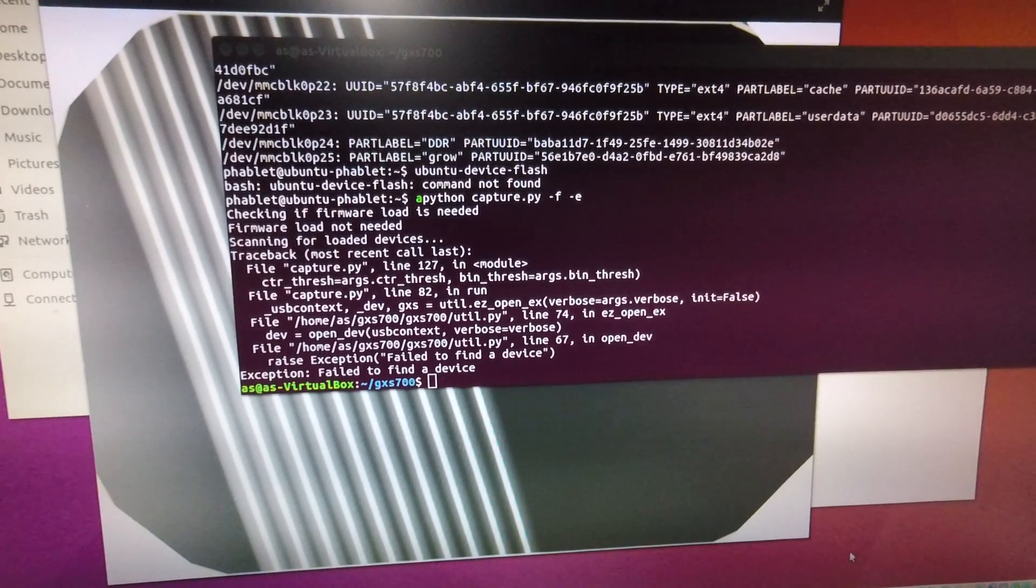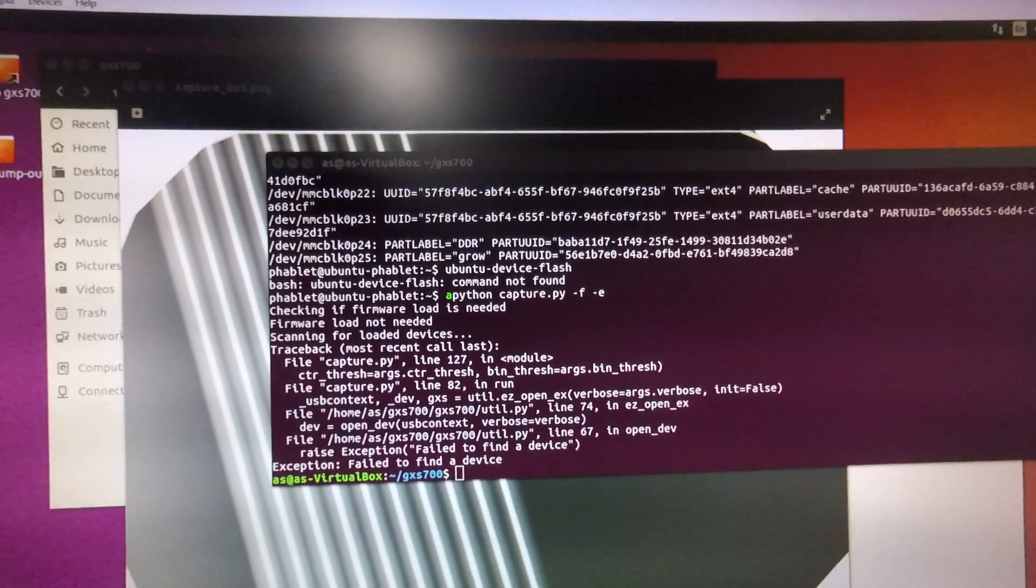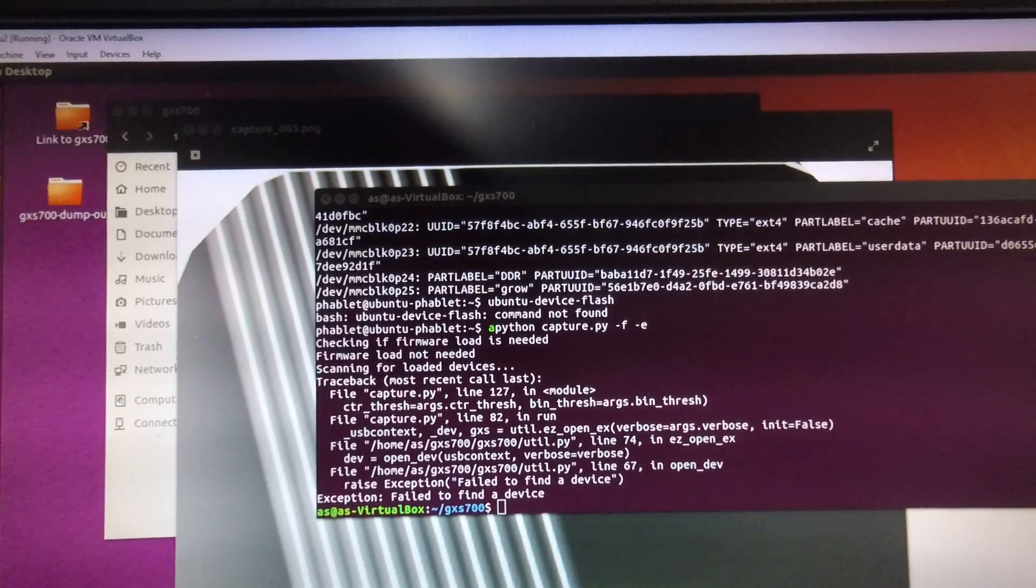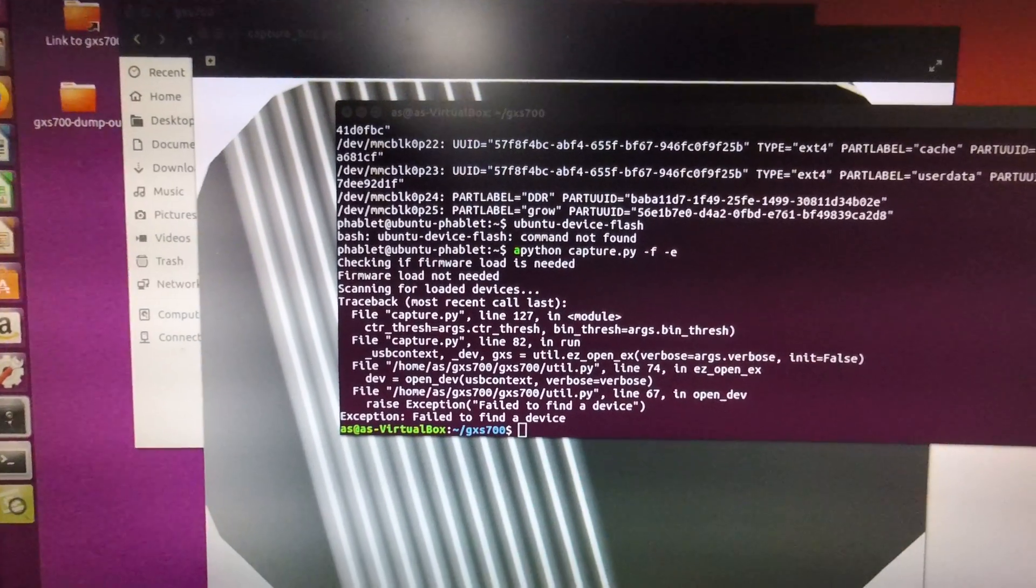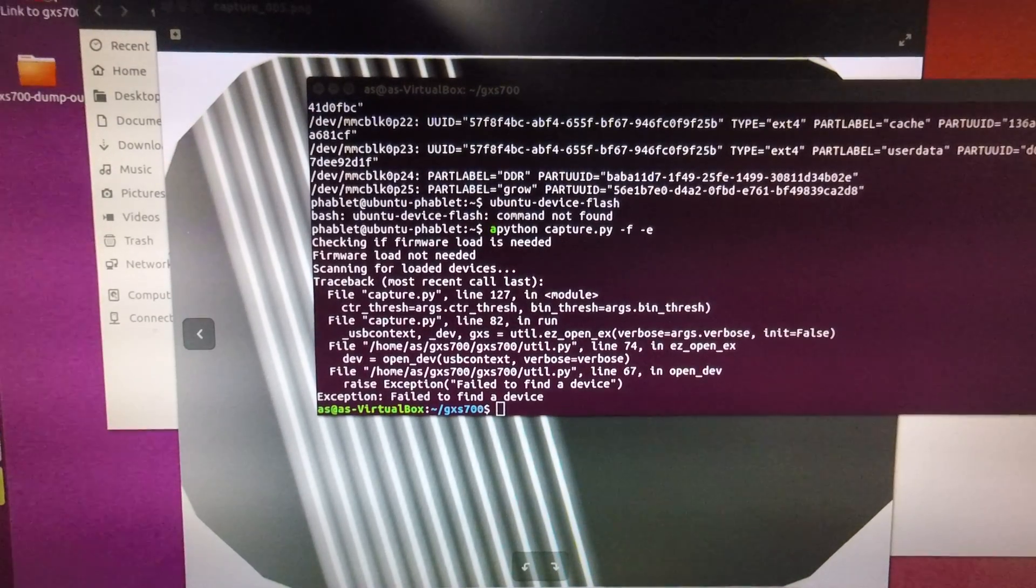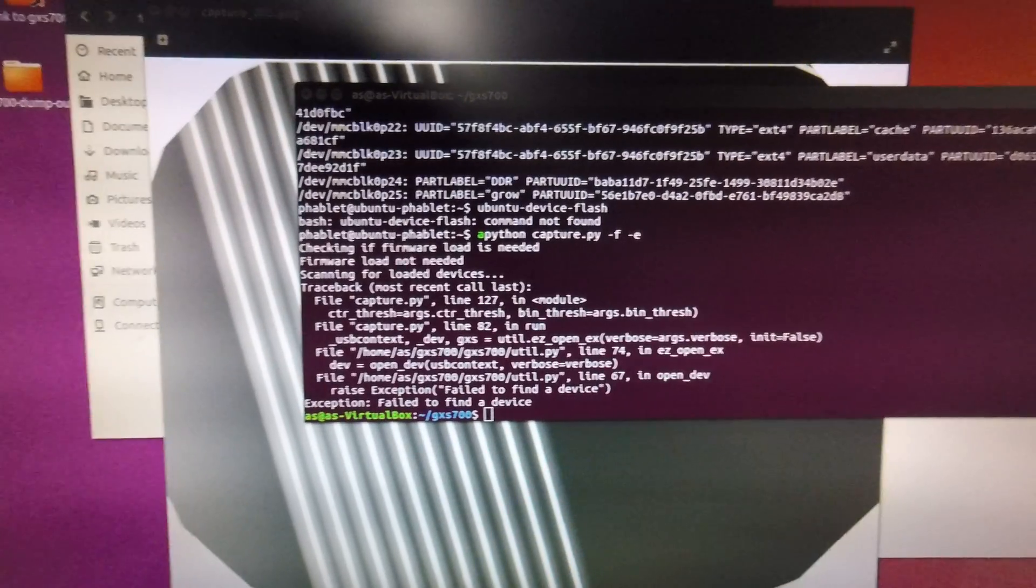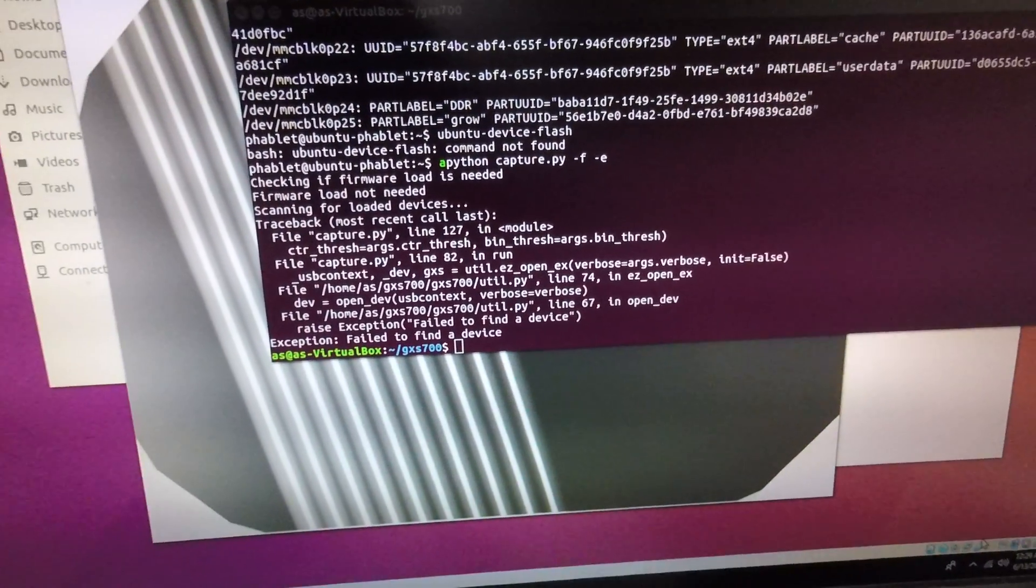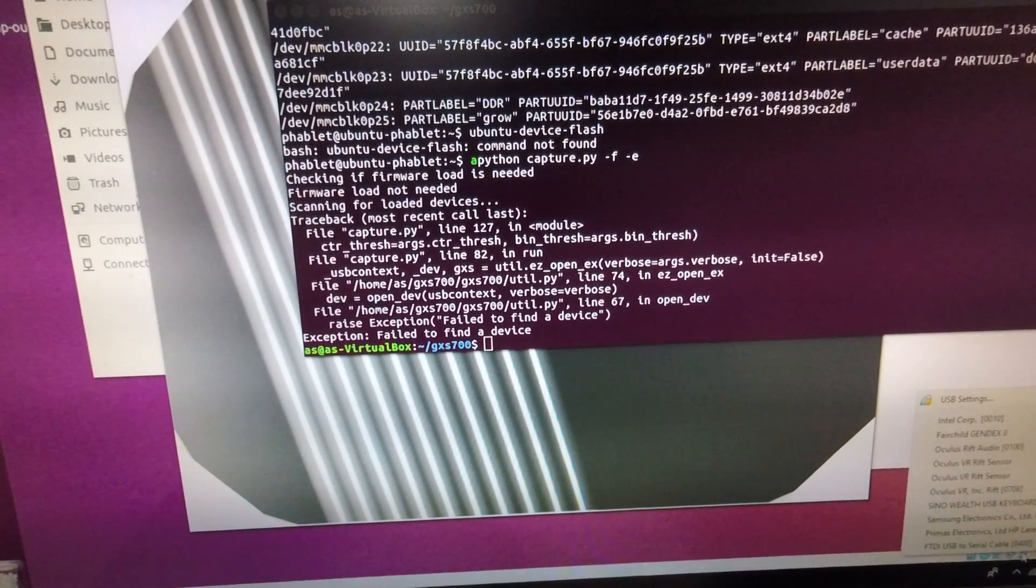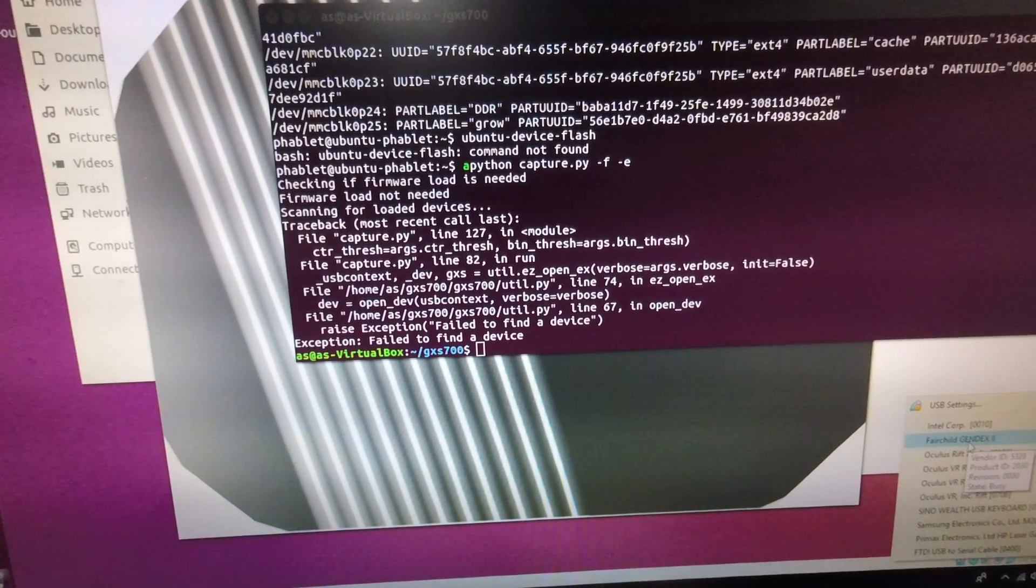Now what I have here is a virtual machine running Ubuntu 16 version 16 and it's running on Oracle VM VirtualBox. So down in the corner of the screen there is a USB plug. If you right click that you can click on Fairchild Gendex 2.